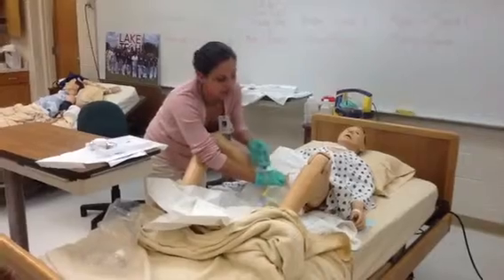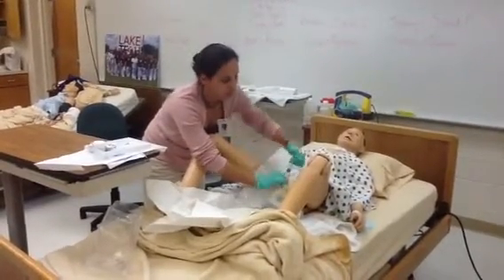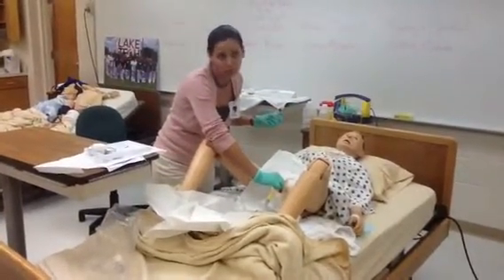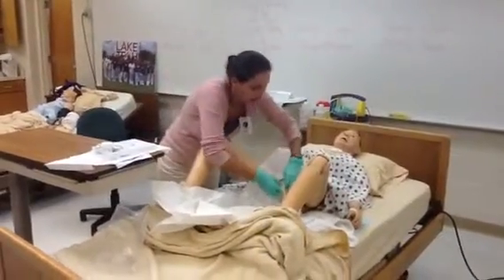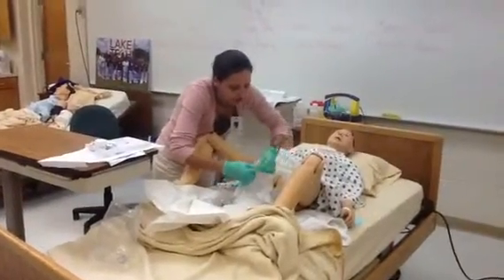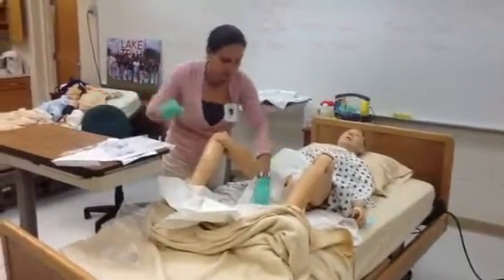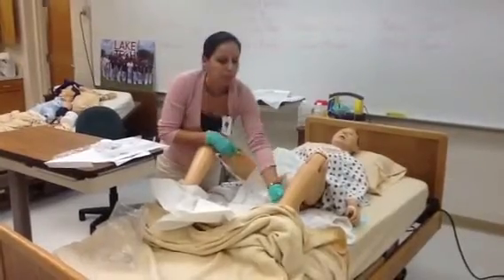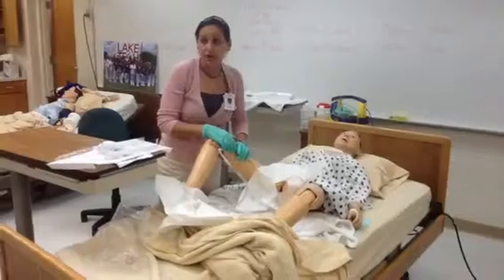And then I'll take my other hand, and I will inflate my balloon, and then I will detach it. Shouldn't have sprayed. At which time, I'll go ahead and take the rest of the plastic sheath off of around my catheter, discard it. Put my patient into a comfortable position, secure this to their leg.